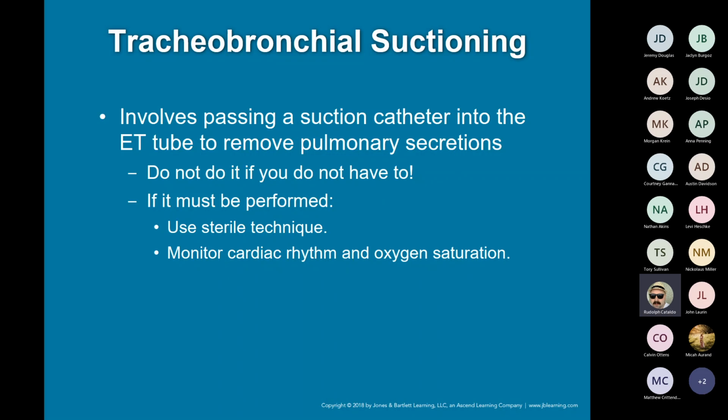So anything liquid in the ET tube is bad, right? Because we need the ET tube to breathe for the patient. So something as simple as lowering suction down through the tube. Think back to the mnemonic that I talked about, DOPE: dislodged tube, obstructed tube, pneumothorax, or equipment failure. We have to check one of those if our intubated patient starts going downhill.